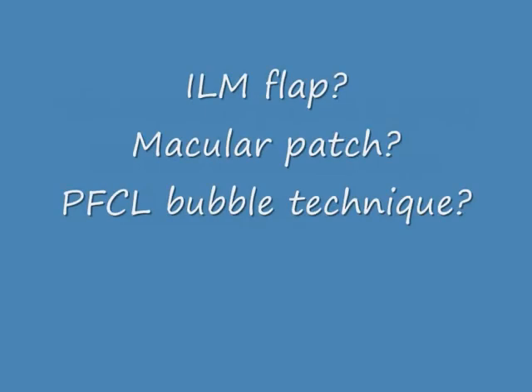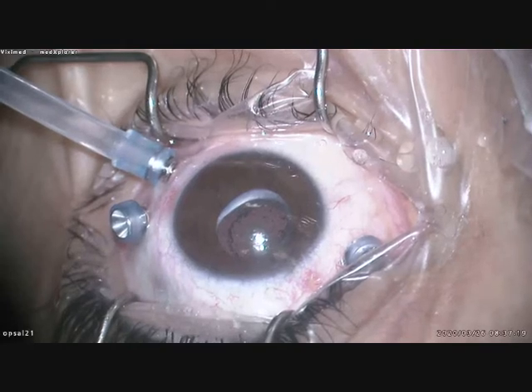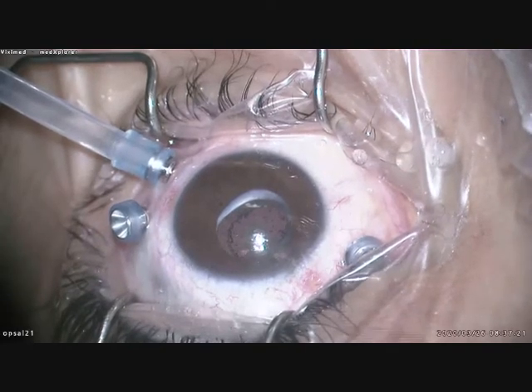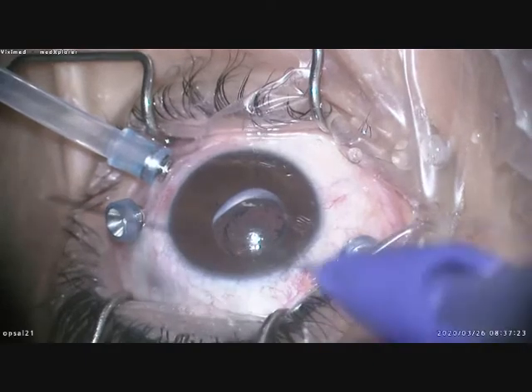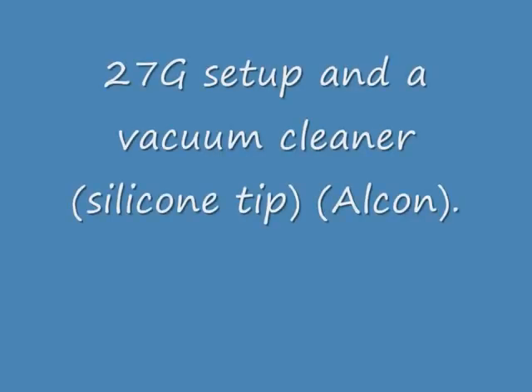What would you do — ILM flap, macular patch, or a PFCL bubble technique? ILM flap is not possible because the ILM was already removed in a previous surgery. This is a 27-gauge setup using an Alcon vacuum cleaner, which is a silicone tip flute needle.